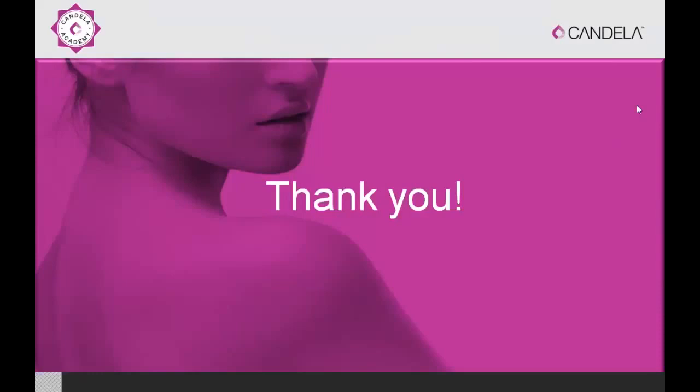There's another question on melasma, whether one can use higher fluences and get quicker clearance. I wouldn't recommend that. We know from experience and from all the studies with the nanosecond that using higher fluences with melasma could aggravate it and could potentially worsen melasma, so I would limit that to lower fluences rather than higher fluences.